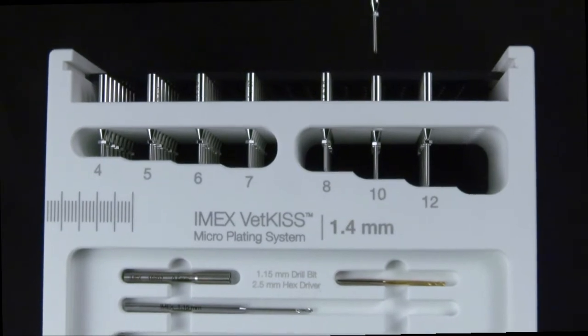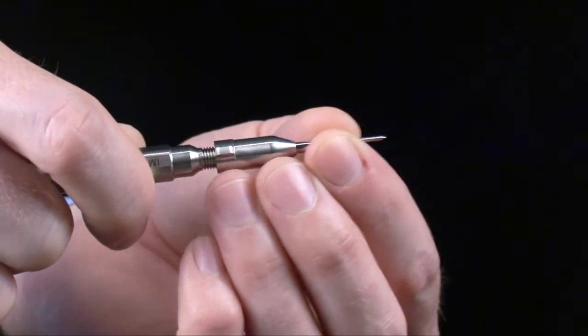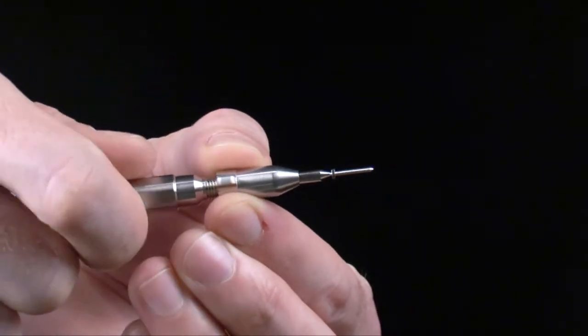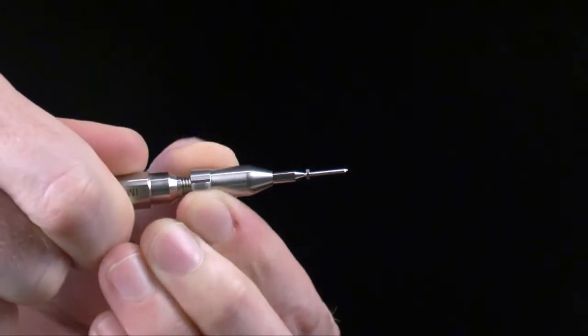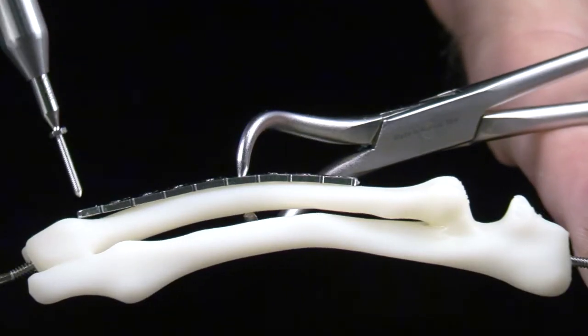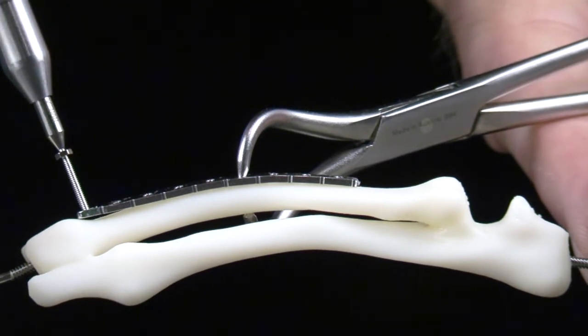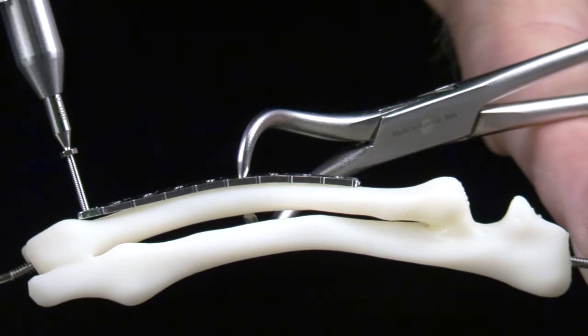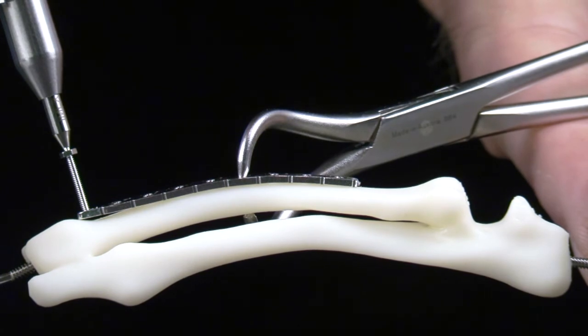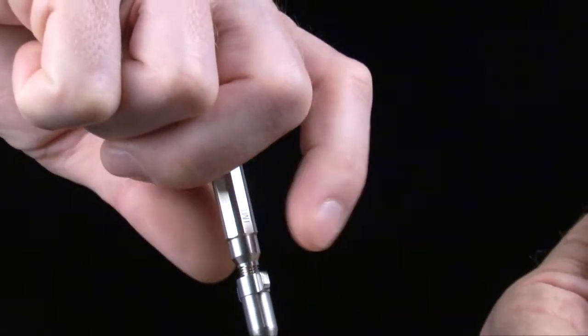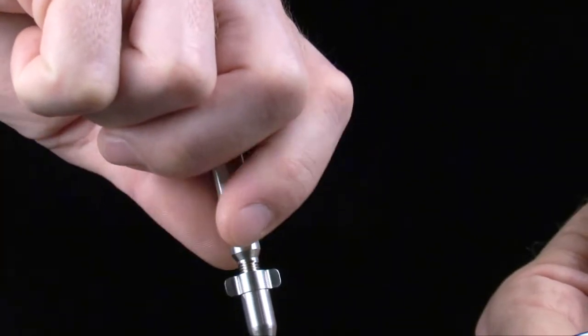Select the proper length screw and load it into the finger driver. Align the screw and finger driver perpendicular to the plate surface at the plate hole being filled. This is visually verified just as was the proper orientation of the drill bit. Thread the VetKiss screw through the bone plate and into the bone.